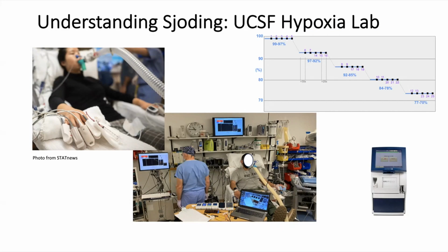So we decided to use data from our laboratory during controlled desaturation studies to see what factors contributed to pulse oximeter bias. We wanted to understand why the pulse oximeter reading was different from the true value as assessed in a bench oximeter. And the studies overall involved controlled desaturation levels between room air levels and all the way down to about 70%.